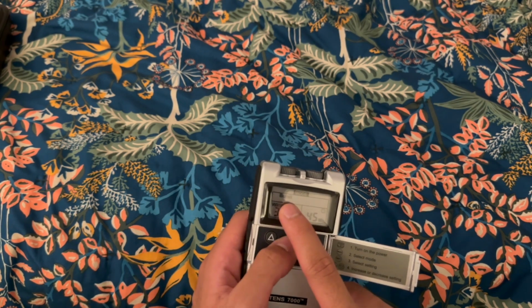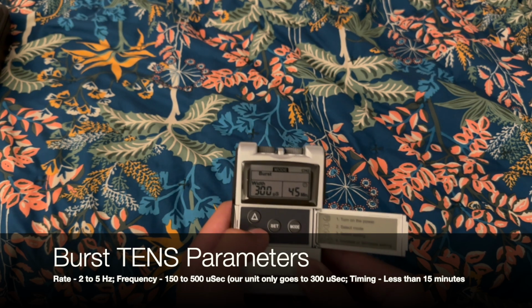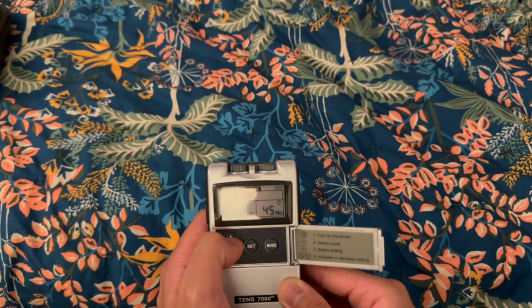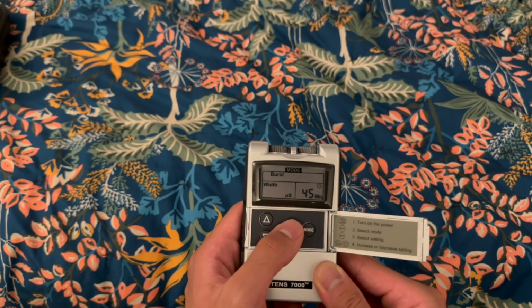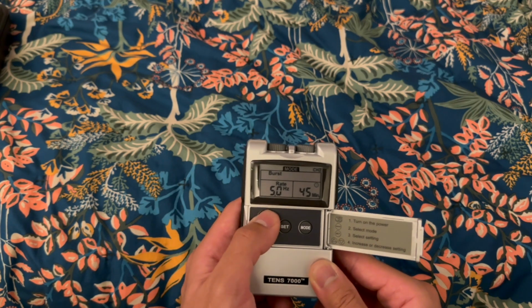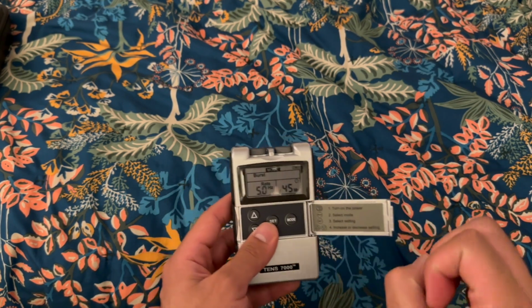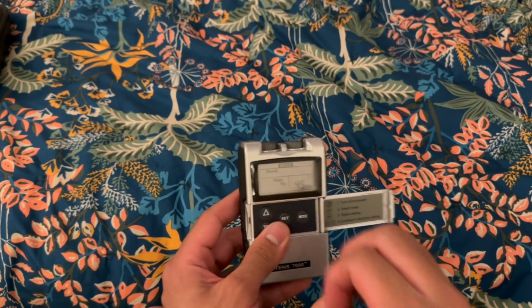Now, when it comes to our last mode, burst, we'll change these numbers because they'll be preset, where our width is going to be between 150, so all the way down to 150, and all the way up to 500. However, our unit only goes up to 300, so we'll just stick to 150 to 300. Our rate is locked at 5 hertz, so we'll be between 2 hertz to 5 hertz for this frequency. It's almost like acupuncture in itself, but it's a very, very strong stimulus. And it'll just go like bam, bam, bam, bam, bam.